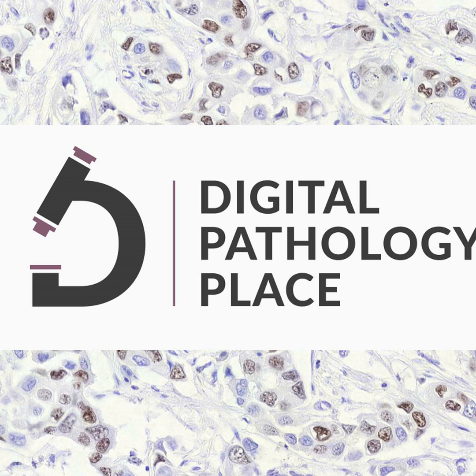They took one unstained section from 100 hepatectomy or explant MASLD cases, 20 of each pathologist-assigned NASH Clinical Research Network fibrosis stage. Okay, so here we have fibrosis stage 0-4. They took 20 of each stage. They used them to create virtual core biopsies by cropping regions from within the whole parent section. They have a whole section and they want to make biopsies out of it.